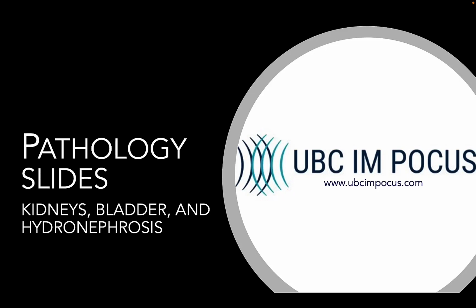I am POCUS again. This is another pathology video, this time focusing on the kidneys, bladder, and examples of hydronephrosis. Again, as a reminder, these short videos are intended to give you some examples of what pathology looks like, as we often learn these techniques scanning normals, so that you can recognize it when you see it in your patients.